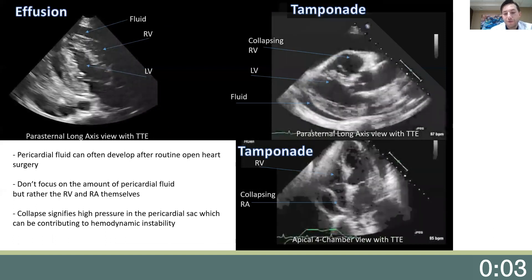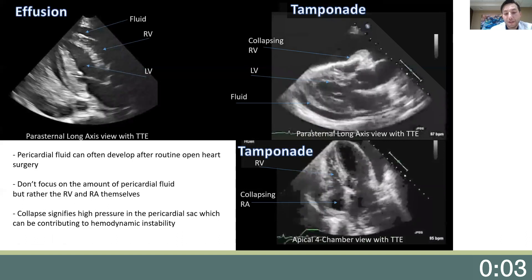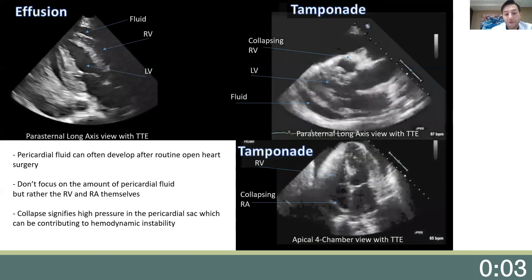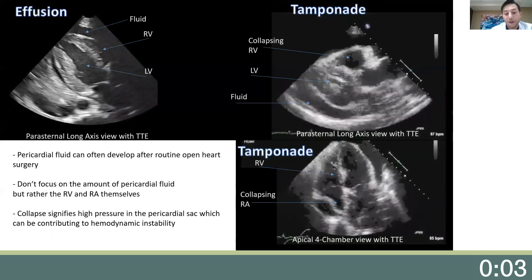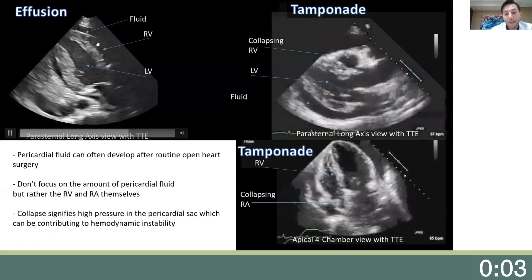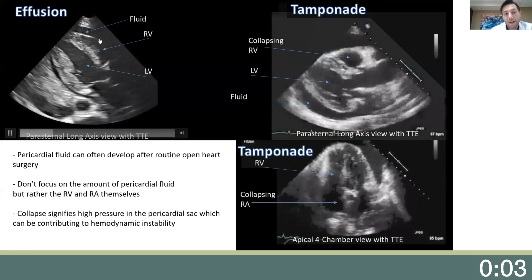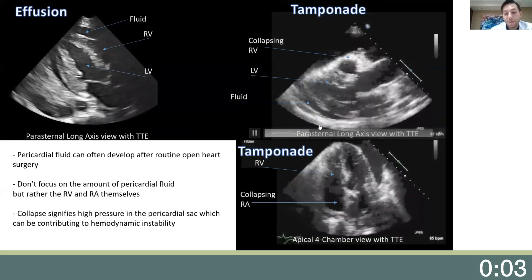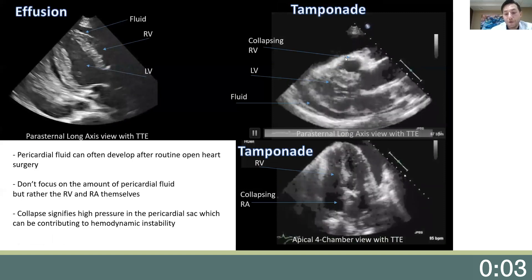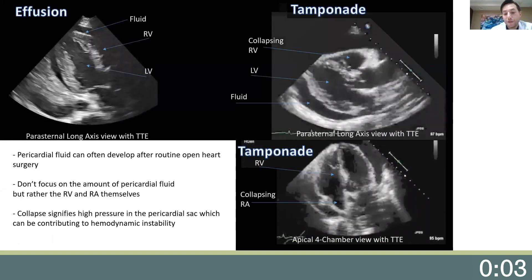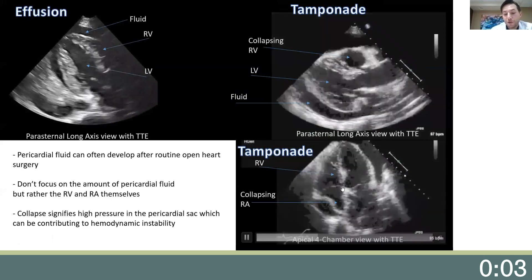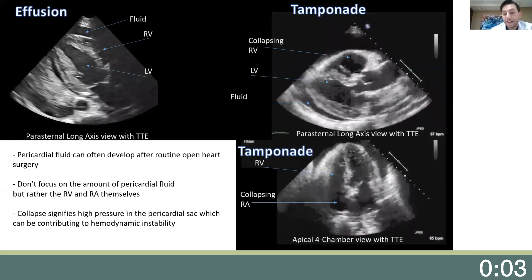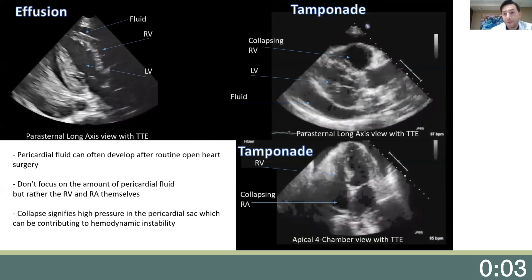Another potential cause of hypotension after heart surgery is cardiac tamponade. Pericardial fluid can often develop after routine open heart surgery, but to know if it's causing hemodynamic compromise, echocardiography can be an invaluable tool. On the top left, we see a parasternal long axis view of the heart with a layer of fluid around it — this fluid is unlikely causing compromise because we see no sign of RV or RA collapse. However, on the right, we have evidence of cardiac tamponade: the top right image demonstrates RV collapse, a sign of elevated pericardial fluid pressures leading to a low preload state. The bottom right apical four-chamber view demonstrates right atrial collapse, another sign of elevated pericardial pressures. These patients need IV fluids and emergent evacuation of the pericardial fluid — you shouldn't waste time adjusting pressors.